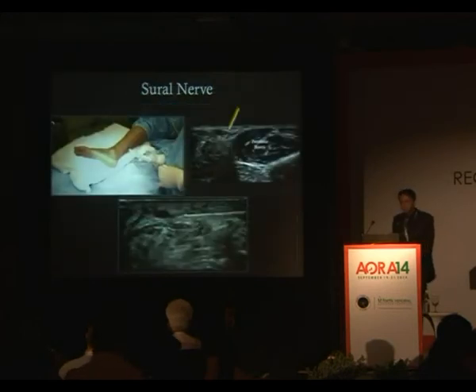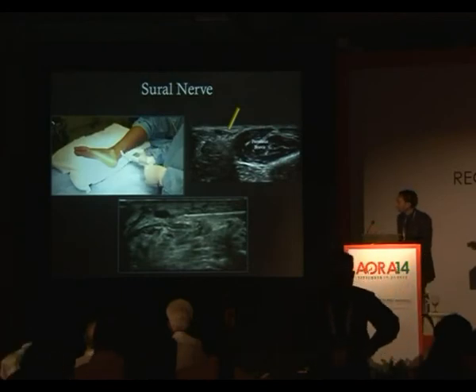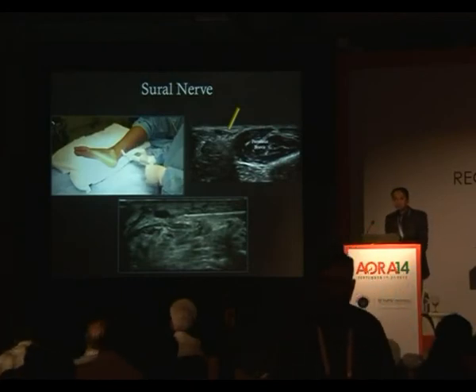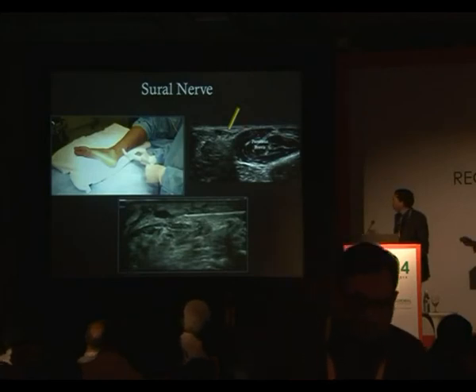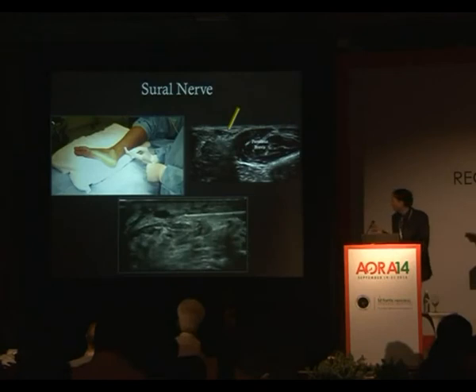The last nerve is the sural nerve, and at this point I've turned my patient lateral, and I'm scanning below the lateral malleolus, looking for the sural vein, the short saphenous vein. Beside the short saphenous vein lies the sural nerve. Again, not very well seen till you inject.